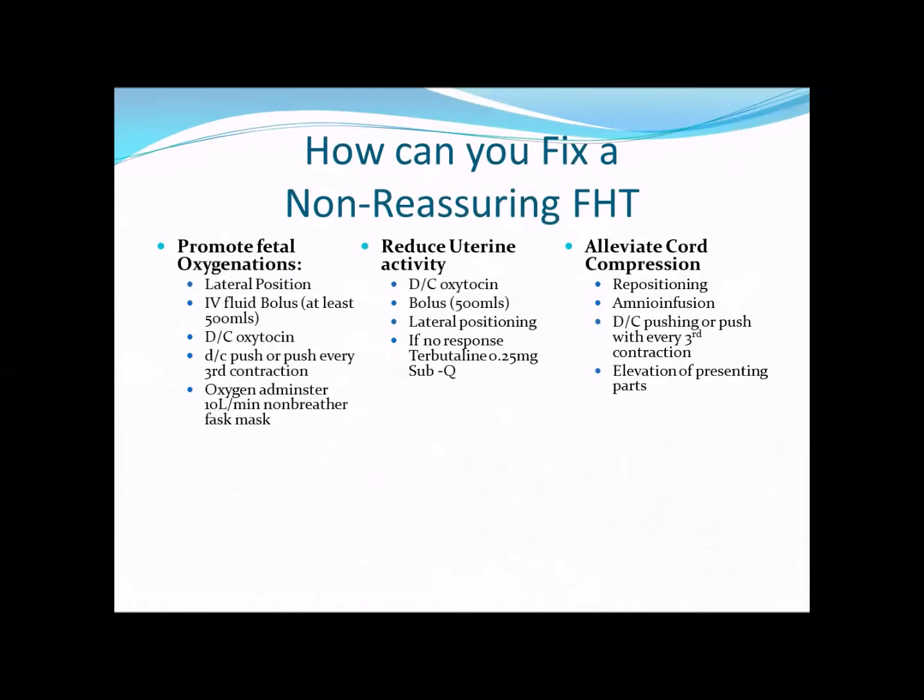Is there a side that's better for moms? Left side. Yep, left lateral. We want to roll moms to the left side. If the baby will tolerate it, we prefer left side, so we tend to try to put that hip roll onto the right if we can. Yep, we're going to give a bolus. If a mom has pit, mom doesn't get pit. No more pit if baby's having any kind of an abnormal tracing. Sometimes if a mom is in a pushing stage, and we're starting to see this, we will hold pushing, and mom has to push every 2nd contraction, every 3rd contraction, and then oxygen. So that's where those oxygen masks come on.